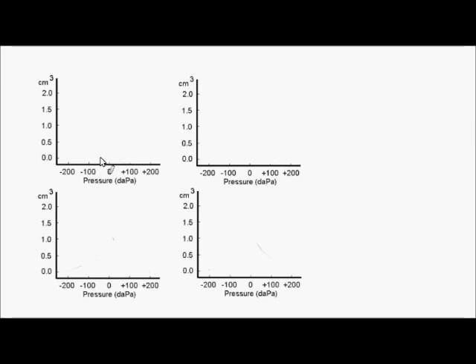This is plotted by measuring the pressure versus the amount of volume in the canal at the time. This changes based on how retracted or lateralized the tympanic membrane is. When you have a normal tympanic membrane, we expect the least amount of sound to bounce back to the probe at room air pressure, or at 0. This tells us that the pressure on each side of the tympanic membrane is the same, and it's called a type A tympanogram, and it looks something like this.